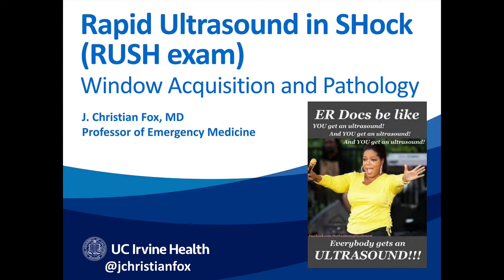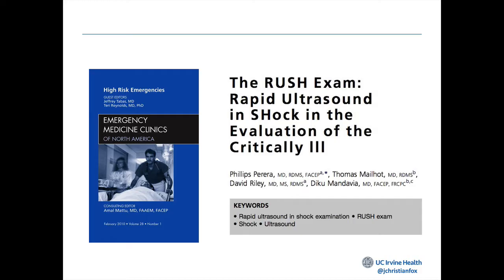Everybody gets an ultrasound." It reminds me of that because we're doing 3 different regions with the RUSH exam: the pump, the tank, and the pipes. Now, there are a lot of other protocols out there for resuscitation: the 7-Up protocol, ACES, the FATE exam, FEEL, all these things. But I like the RUSH exam because it breaks it down pretty simply into the pump, the tank, and the pipes.